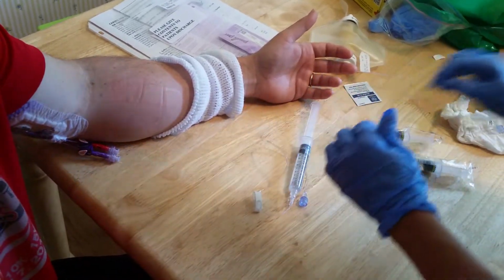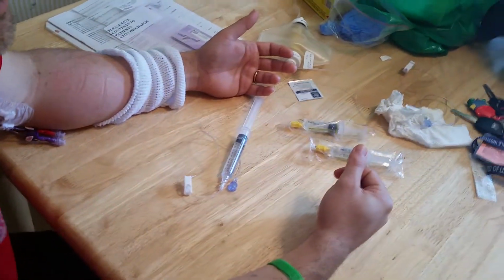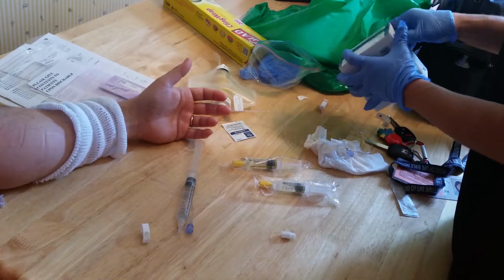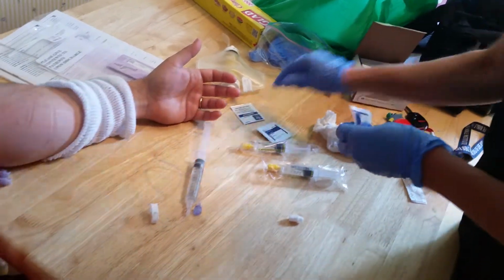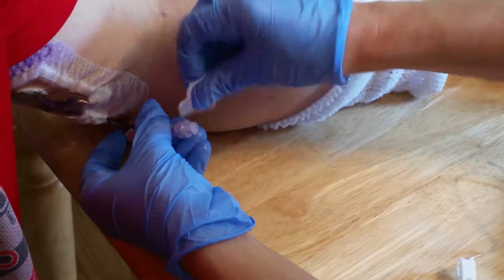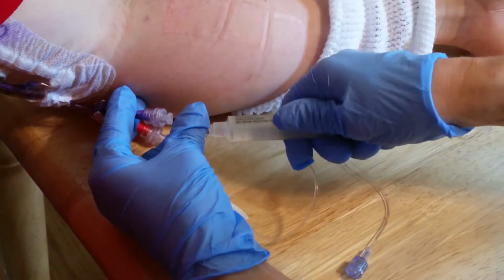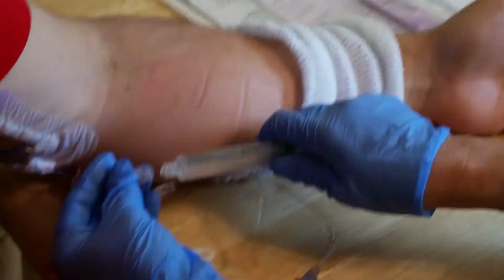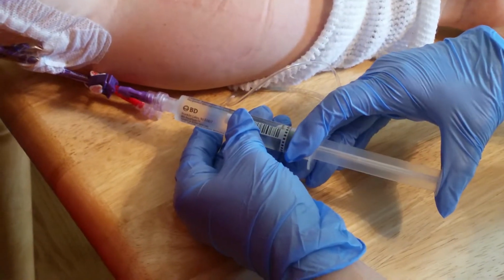I'm going to put another alcohol wipe here. Anytime you do anything with this cap, this is an alcohol first. Oh, there's one right there. So we use this one. And I'm going to disconnect this. There's still bubbles there at the top. This just goes straight into there. You push and twist. Easy. And then you just flush it.